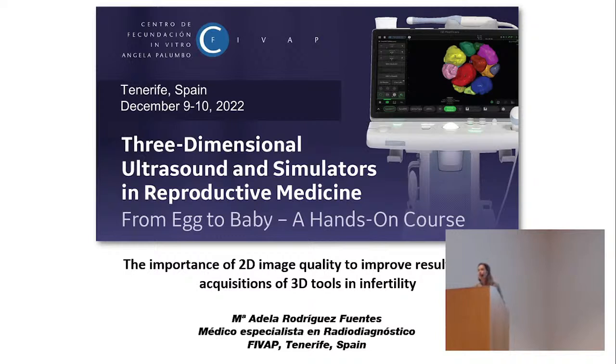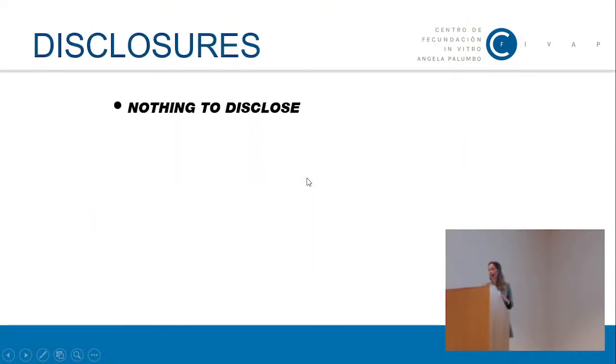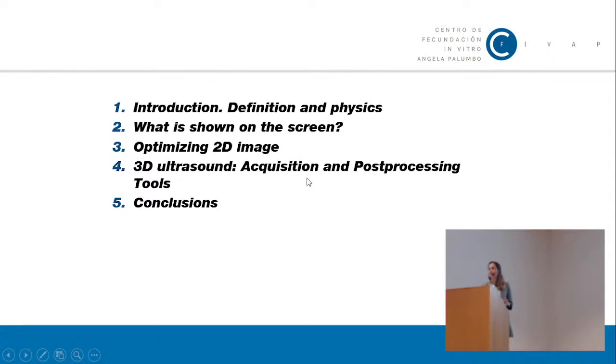Medical ultrasound is based on the use of high-frequency sounds between 2 and 15 MHz to aid in the diagnosis and treatment of patients. It gives us real-time images by the reflection of the ultrasound wave on the organ surfaces, whose echoes are captured by the transducer.